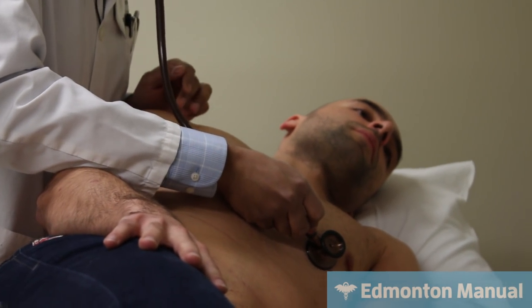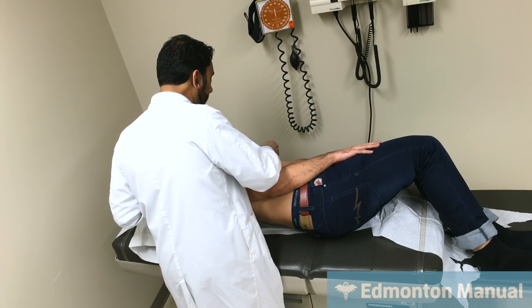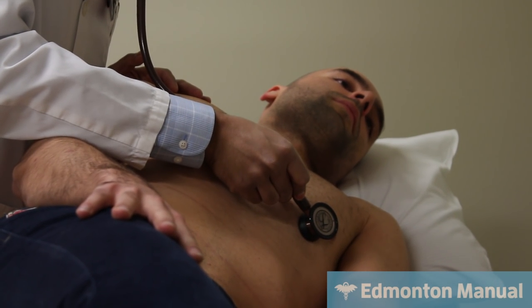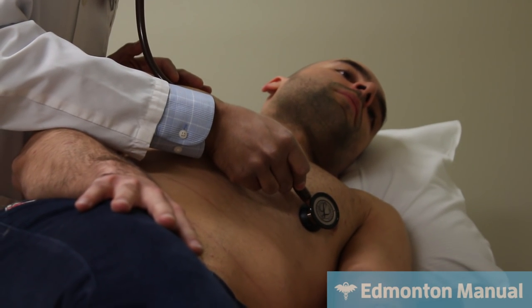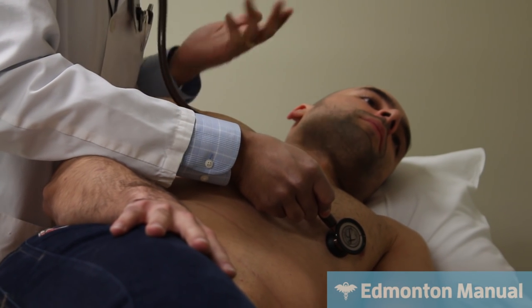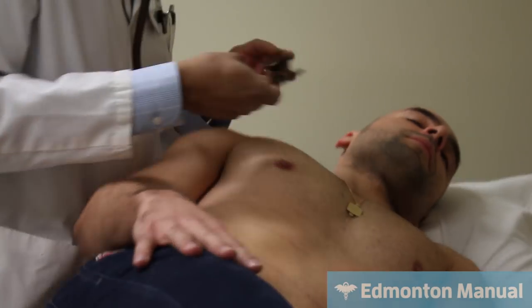And I don't appreciate any low frequency sounds. Or I can turn over to the proper bell and just very lightly make a seal. And I don't hear any low frequency sounds. In a young, healthy male, we could very well get an S3, which can be physiologic. Okay, great, you can roll back over.